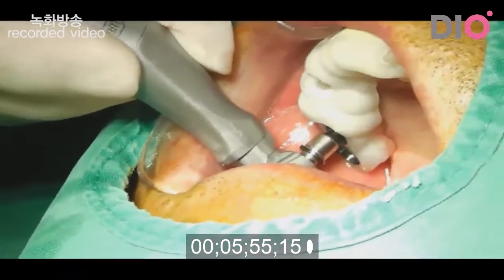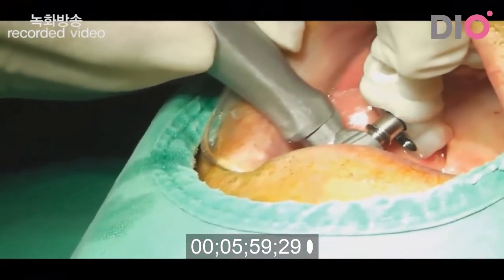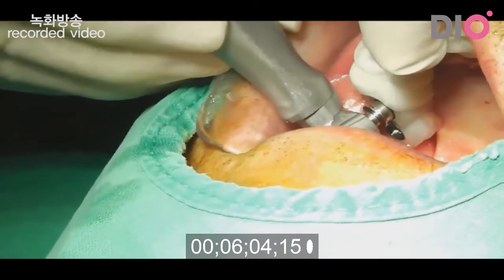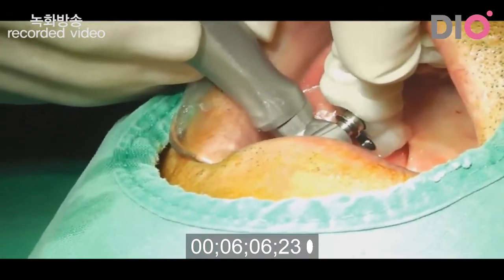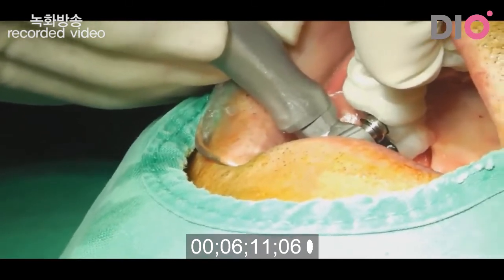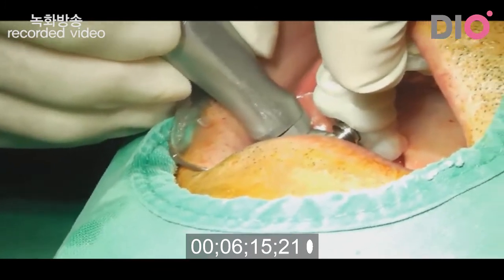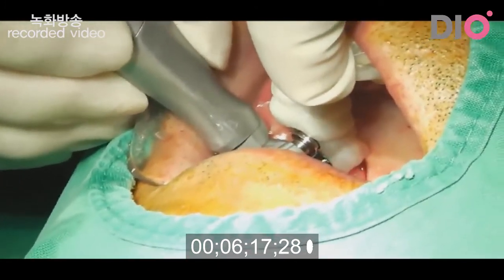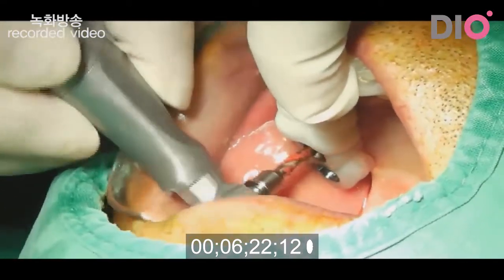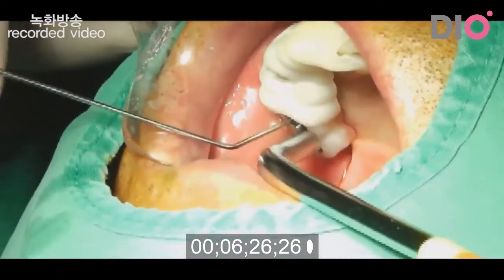This angle. Okay. I finished the drilling 2.7 drill below the sinus floor.